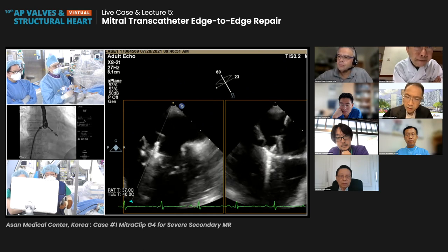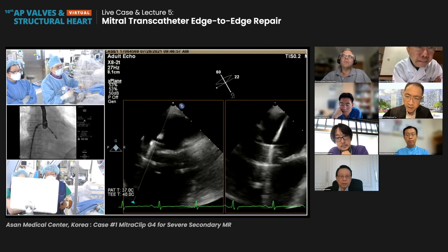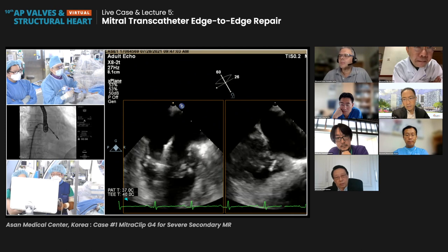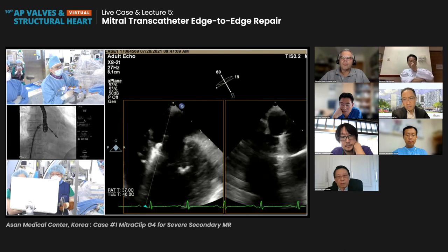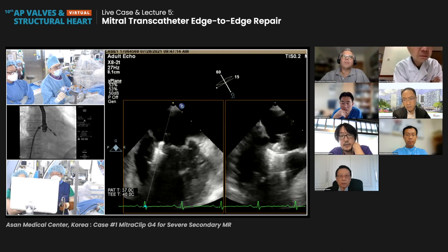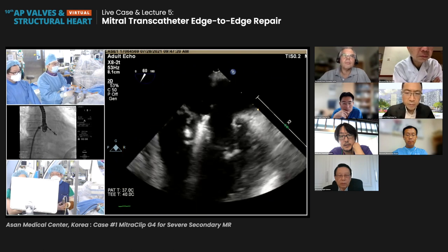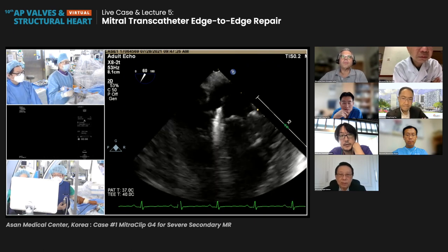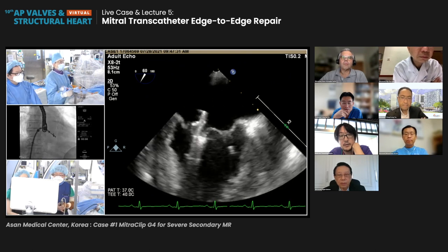Are you still grasped to the anterior? Is your anterior leaflet independently grasped? No, it's not. I'm not yet using the independent grasper. I will do it simultaneously, and if it doesn't work, I will do the independent grasping. So now the location is not A1, A3, P3, it looks like. You might want to do a respiratory hold. Move the clip more medially. It's in the central position right now. It is possible to go back to the LA and start from the top. Okay.